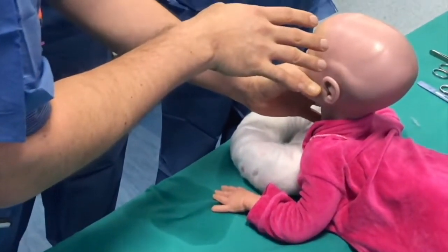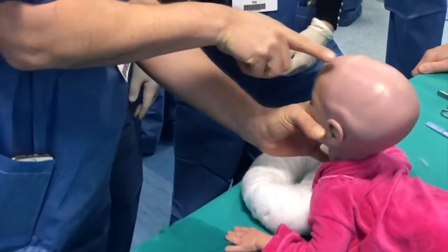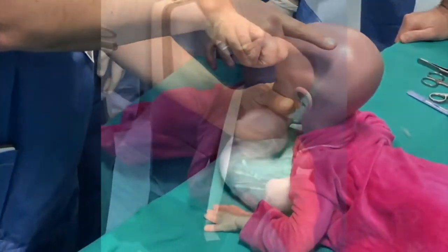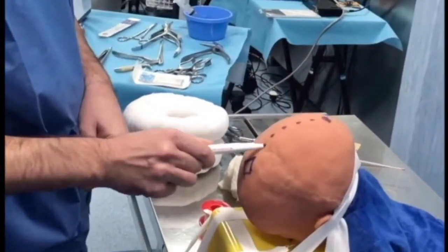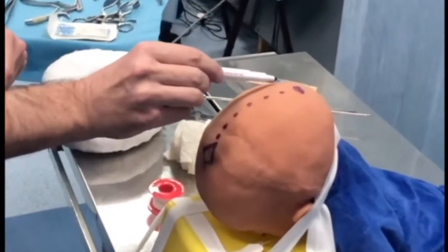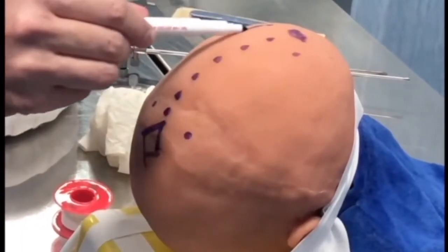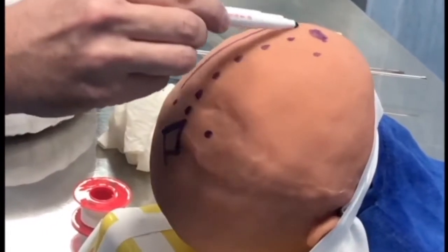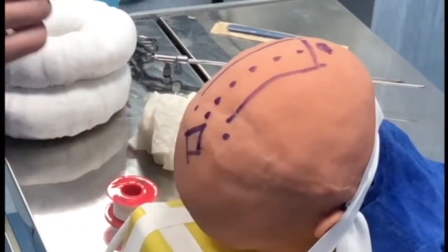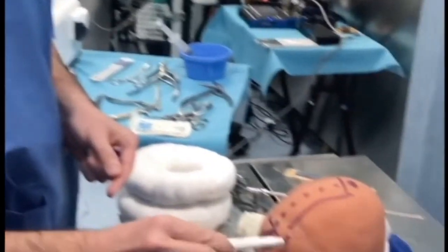For scaphocephaly, the model is placed in sphinx position, taking care that the head is placed as extended as possible, parallel to the floor. For training purposes, the areas of the intended bone resection are drawn on the skin. Next, the skin incisions are drawn, one behind the anterior fontanelle and one before the posterior fontanelle.